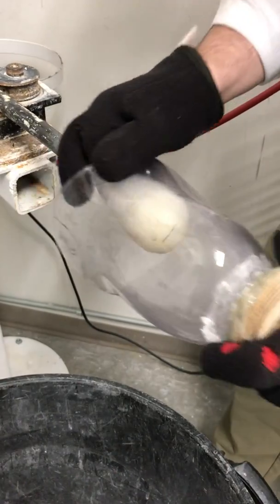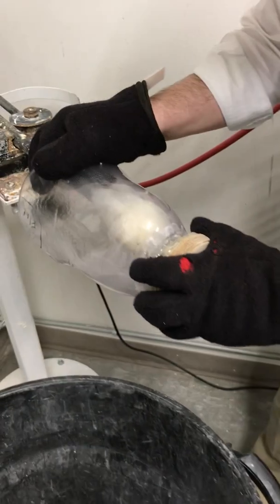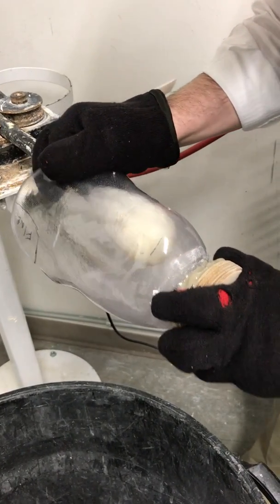Once you've got the shape that you want, you can use compressed air to cool it off more quickly, or if you want, you can just hold it and let it cool on the tool so you keep your shape.